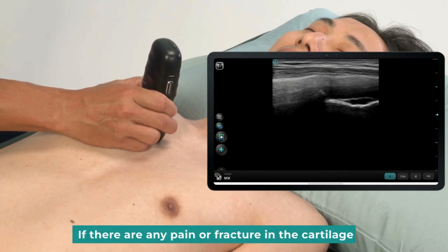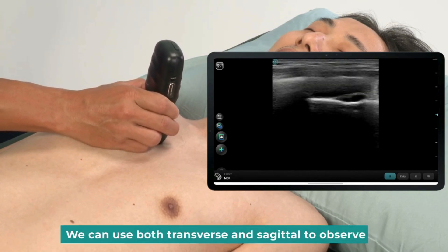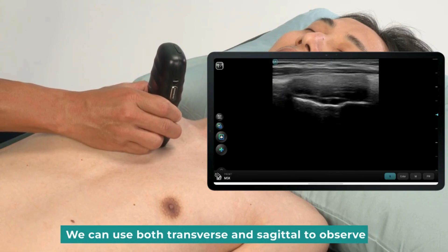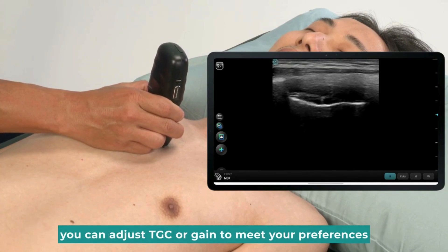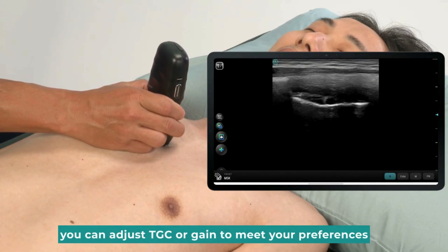If there is any pain or fracture in the cartilage, we can use both transverse and sagittal views to observe any abnormality in the upper and lower part of the cartilage. You can adjust TGC or gain to meet your preferences.